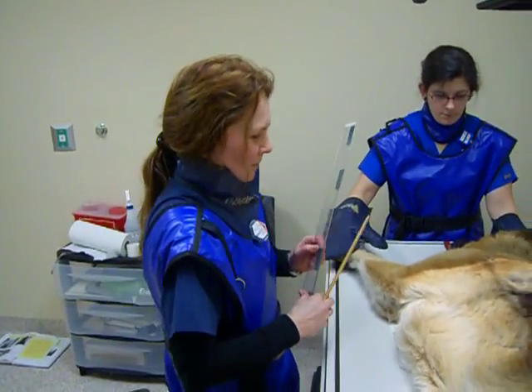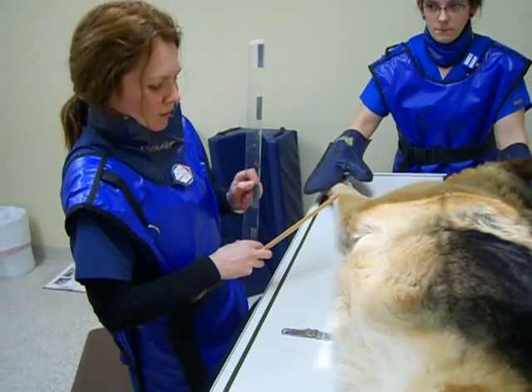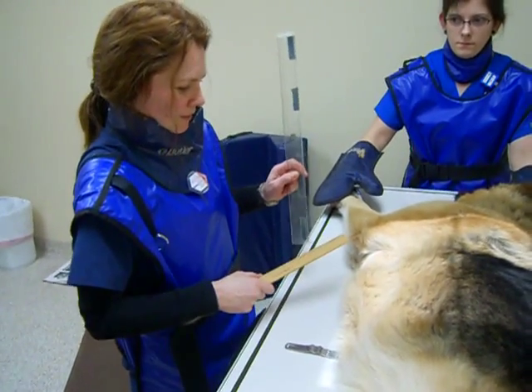I'm going to demonstrate how to position and measure for a right lateral thoracic radiograph on a 75 pound German Shepherd.